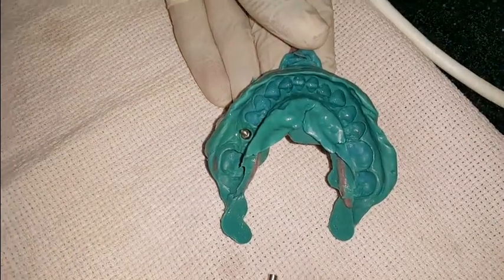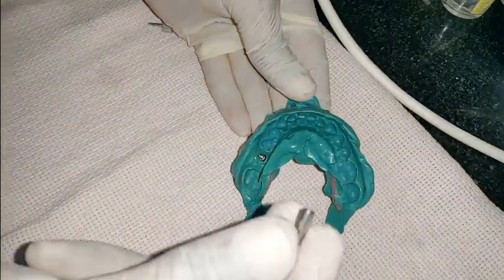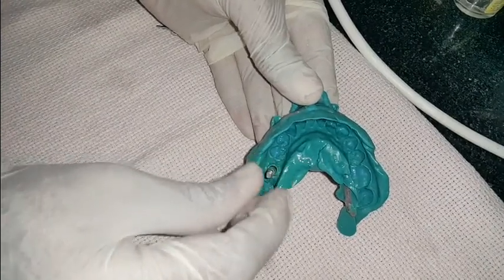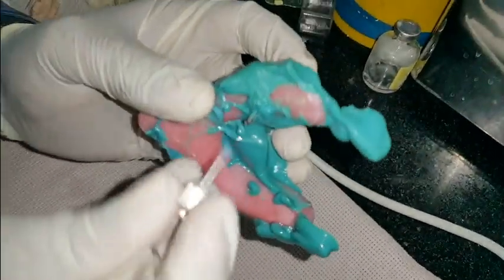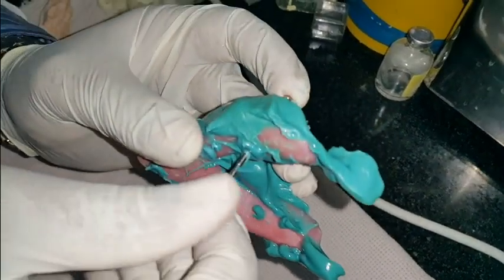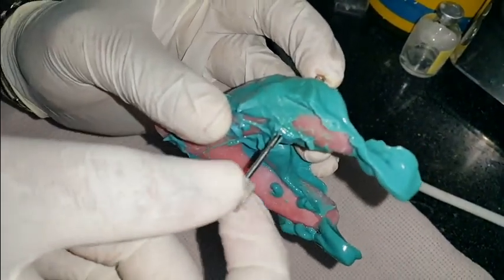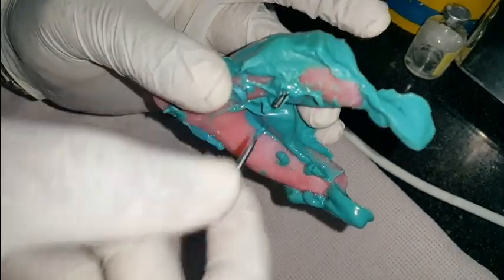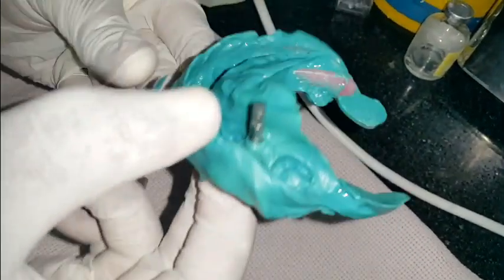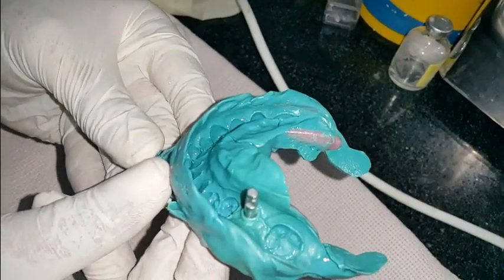Now after retrieving this impression I will connect this implant analog to the impression coping like this. You have to check the fitness, and after connecting the implant analog I will tighten the screw so that the impression coping will fit perfectly in the implant analog. Now this assembly will be sent to the laboratory for further prosthetic work.